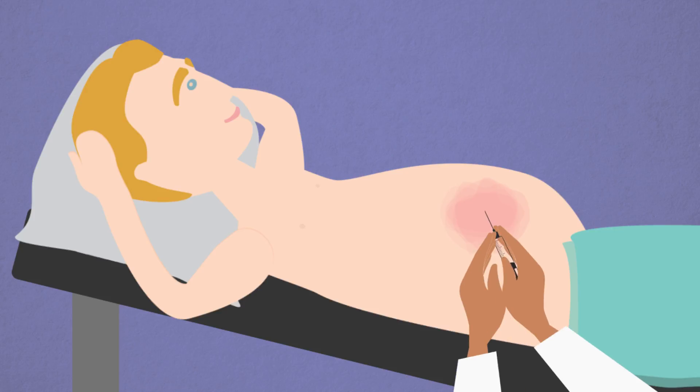Next, numbing medication will be injected into the skin. You will feel a prick when the numbing medication is administered with a small needle.